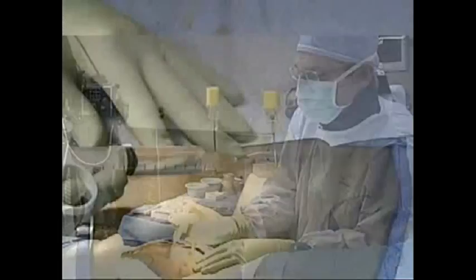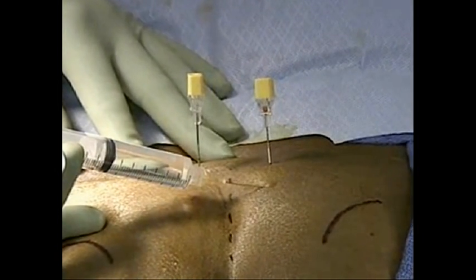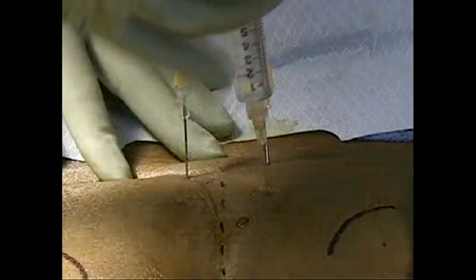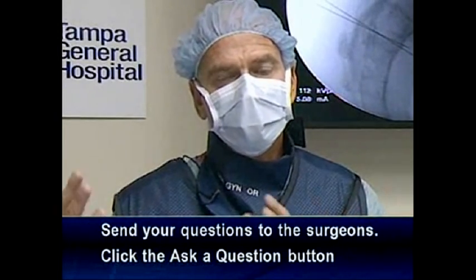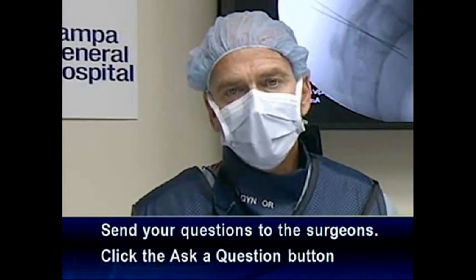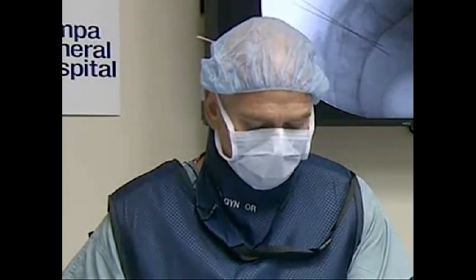While he's numbing up the patient, there's a question about stress incontinence. Some patients have had sling procedures for stress incontinence. We have to differentiate between overactive bladder or urge incontinence and stress incontinence. Stress incontinence is more of an anatomical problem. This therapy is purely for patients with some component of urge. Patients with stress incontinence need to be evaluated for surgical procedures, and some patients can use Kegels to strengthen the muscles. This is not for pure stress incontinence.